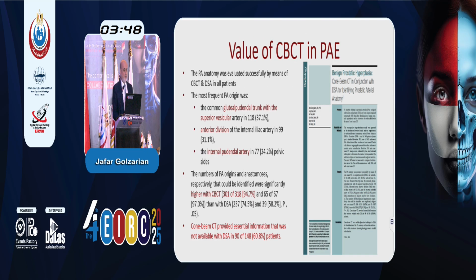So there are a lot of publications, and this study, sorry, it was not a meta-analysis, was very important. It shows that cone beam CT provided close to 60% of information that was not found by DSA alone.